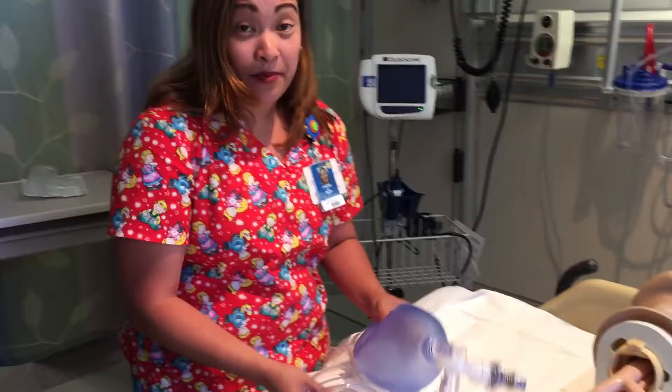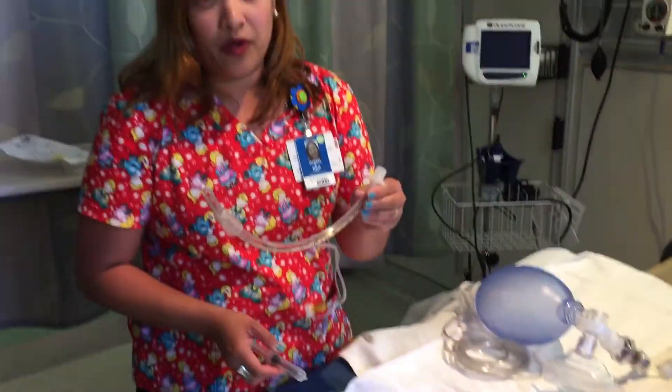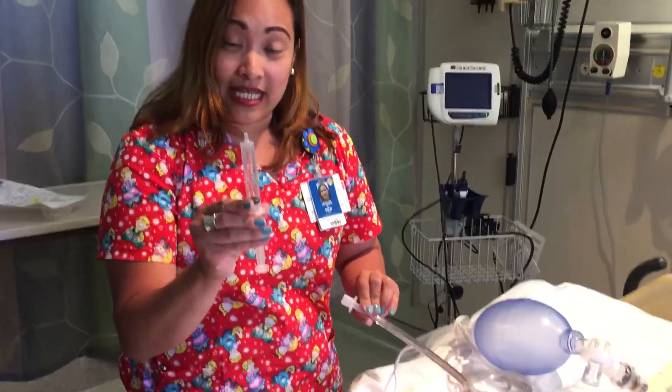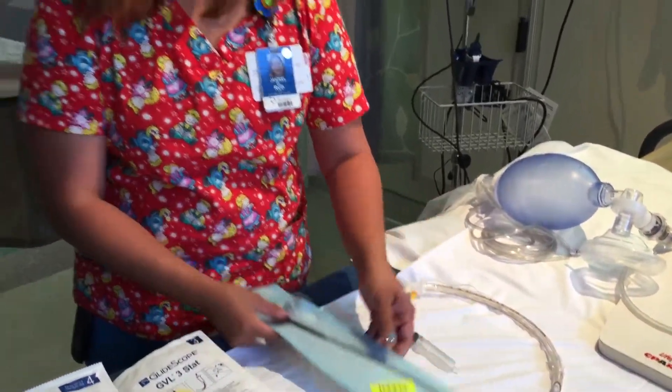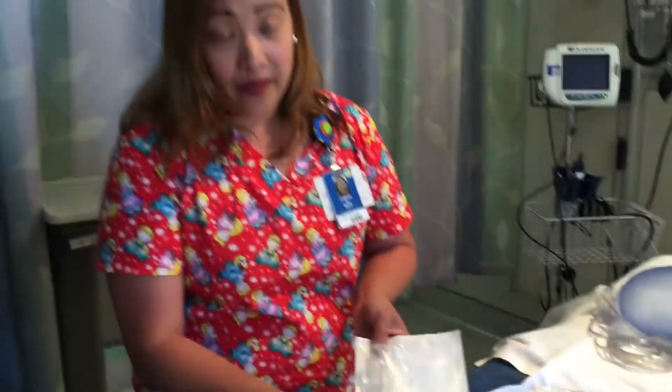First of all, let's talk about the equipment that we're going to be needing for our intubation. First, we need an ambu bag. We need a proper sized ET tube for your patient, already checked — and to check that we need to use a syringe. We need to have a stylet and we need to have a blade that we're going to use for intubation.